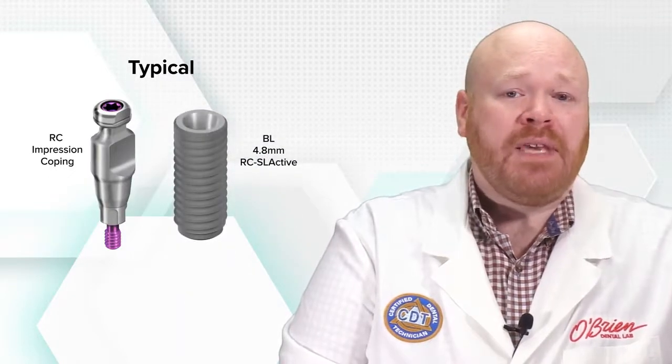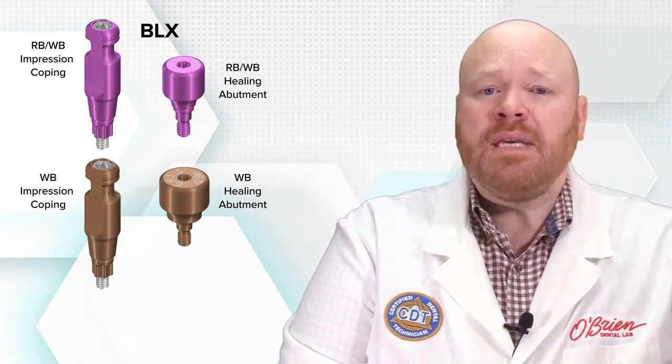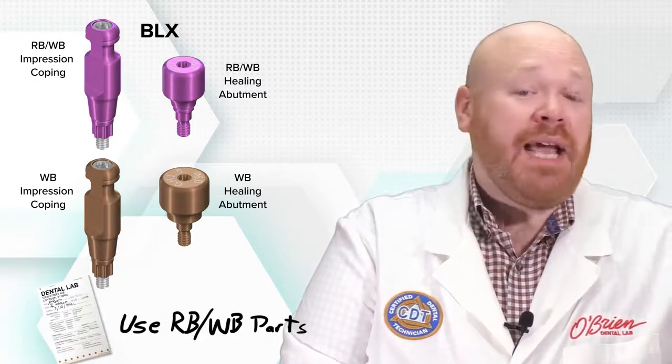So how is this prevented? Typically when you're ordering an impression coping, you get one that matches the platform size of the implant. But with BLX, the impression coping needs to match the healing abutment instead. Whether the implant is RB or WB doesn't really matter — what matters is the size of the healing abutment. And remember, the impression copings are exactly the same except for the color, so if you find yourself with the wrong one, just make a note on the RX about what size parts should be used, and you're good to go.